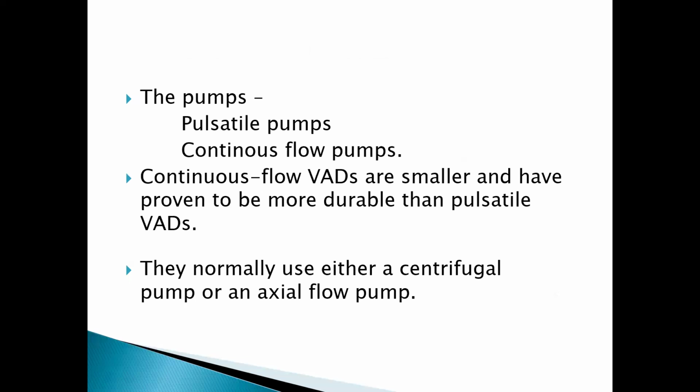Now, these devices are designed to act as pumps, and they have two types: the pulsatile pumps and the continuous flow pumps. The pulsatile pumps mimic the pumping effect of the heart, the way the heart pumps.